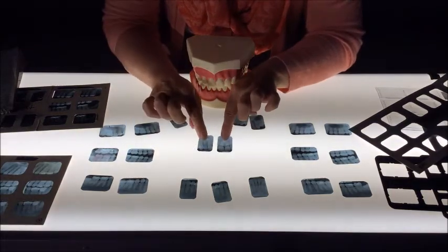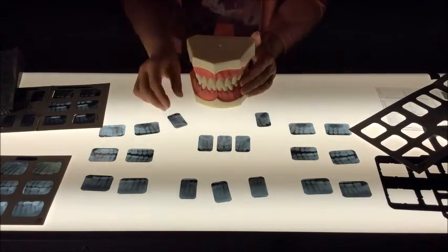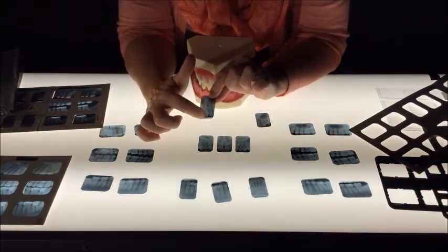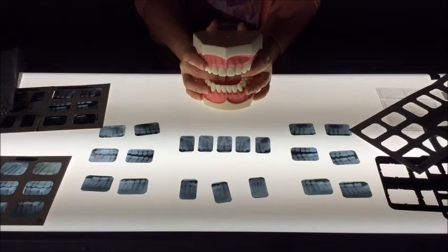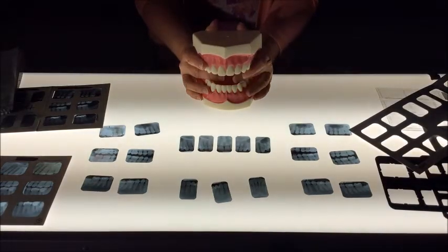Those would be the right and left laterals. The pointed film, where it looks like the crown is coming to a point, is the canines. And if orientated correctly, generally your identification dots should be located down at the crowns of the teeth.